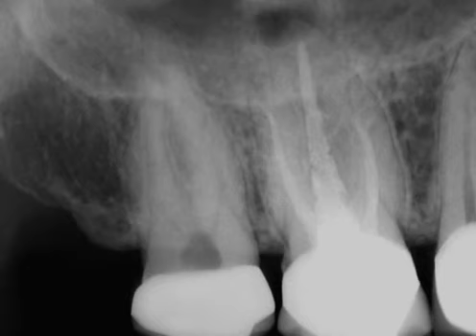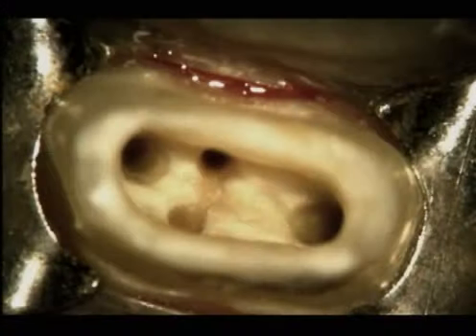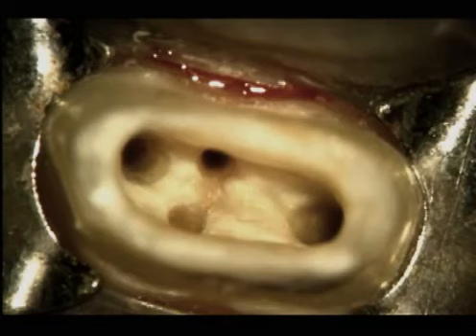A radiograph of an endodontically failing molar shows the previously treated canals are underfilled and underextended. There is suspicion of a second system in the MB root. The photograph at 15x demonstrates crown removal, straight line access, and the identification of an MB2 system. Another photograph shows the pulpal floor and the orifices following canal preparation procedures. Notice we removed all the gutta percha from the MB1, palatal, and DB systems.